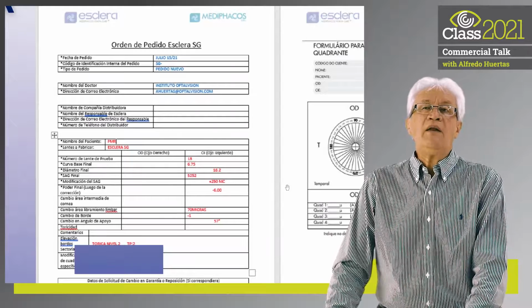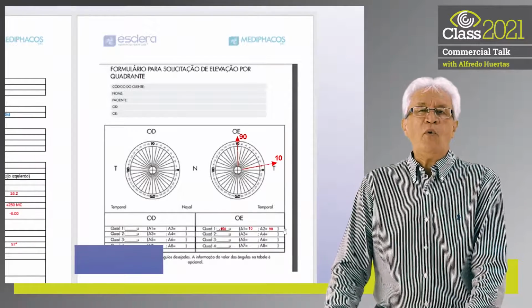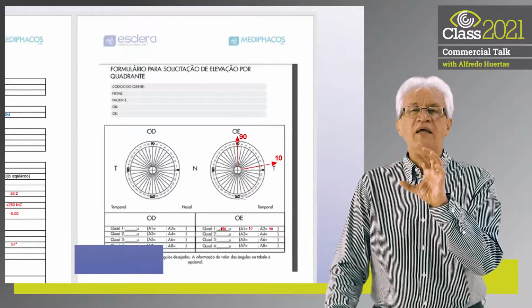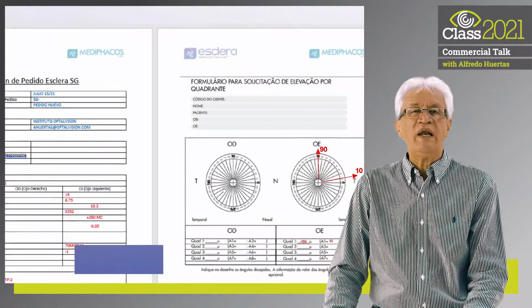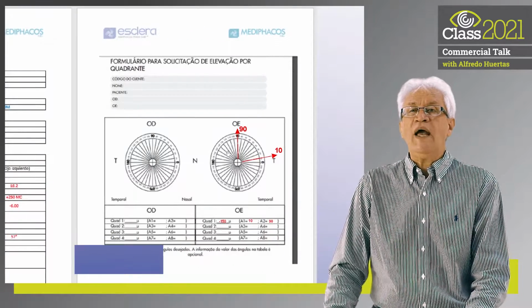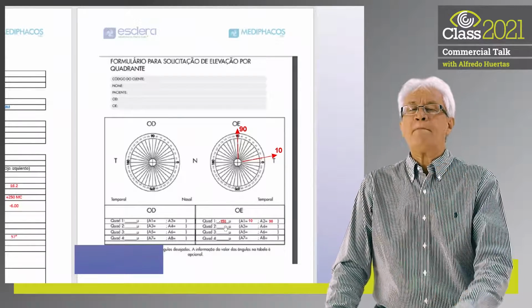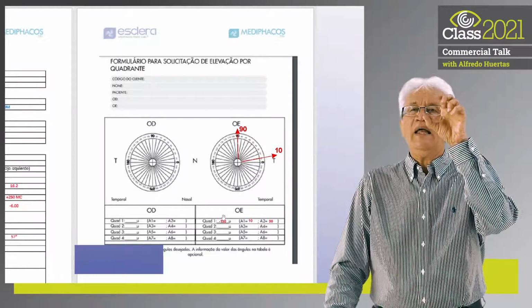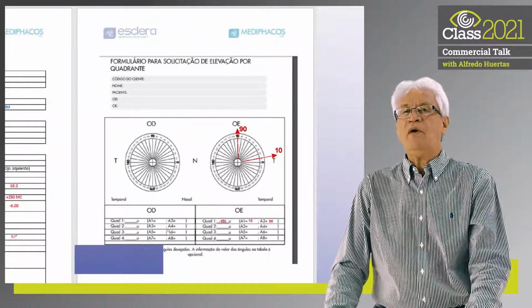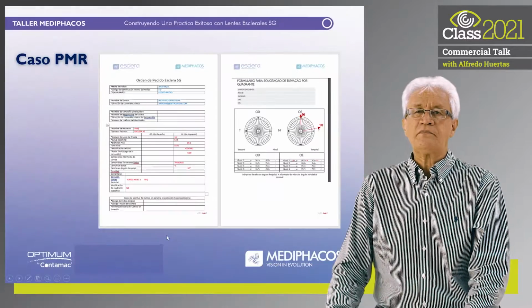Additionally, when I showed them the video of the test lens, when I raised the lens with my finger, the lens then was centered and a central touch appeared. Now that touch made me raise the sagittal height 250 microns. And you can see this here in this zone. In the area between 10 and 90 degrees, I determined to lower that quadrant by 150 microns to avoid the appearance of debris that was already being perceived in the video.